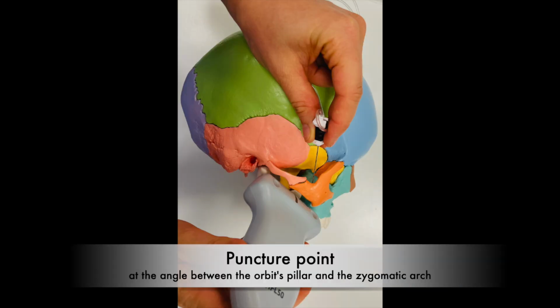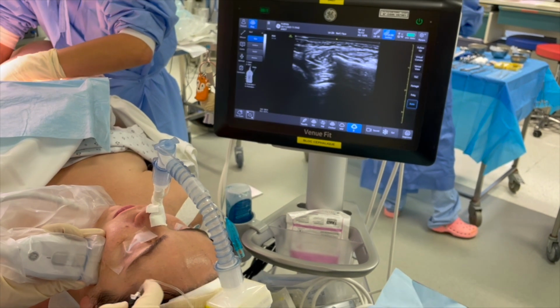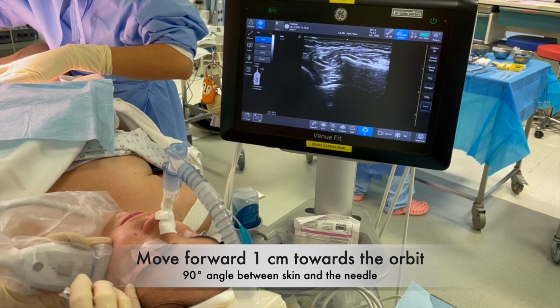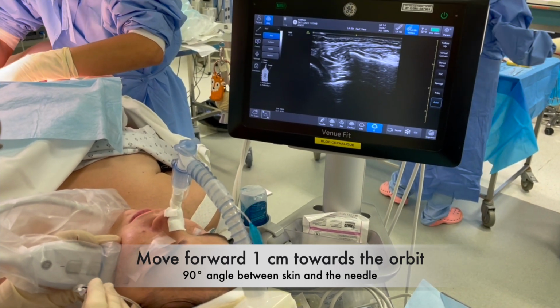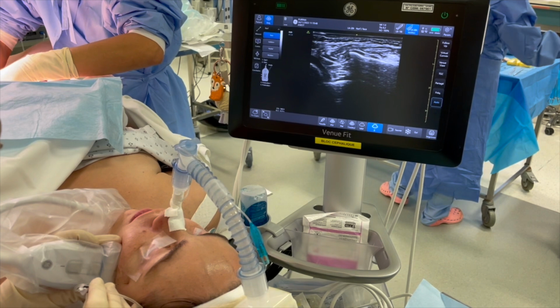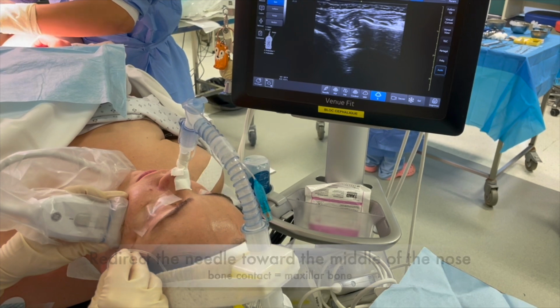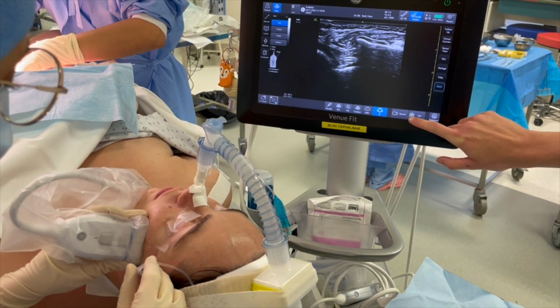The puncture point is situated at the angle between the external pillar of the orbit and the zygomatic arch, using the suprazygomatic out-of-plane approach. Once the skin plane is crossed, the needle is advanced 1 cm towards the orbit with a 90-degree angle between the needle and the skin. Then, the needle is redirected caudally towards the middle of the nose.